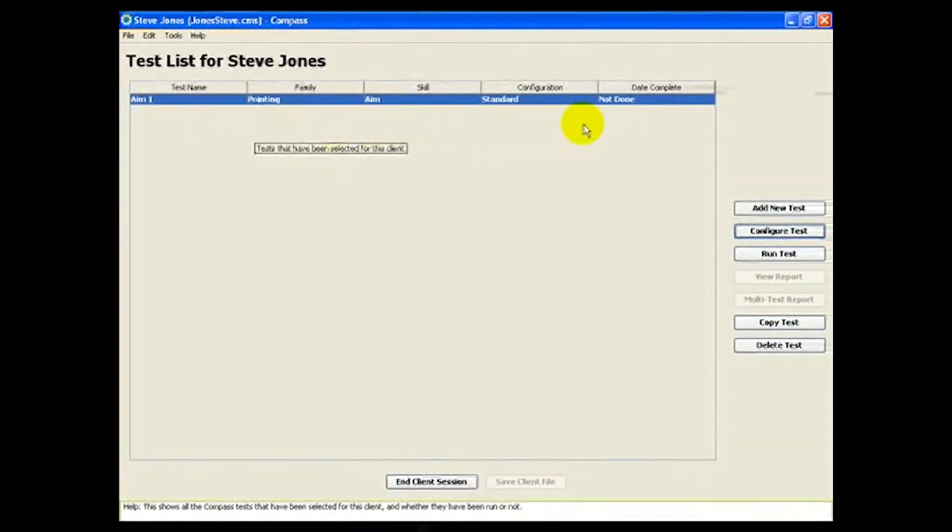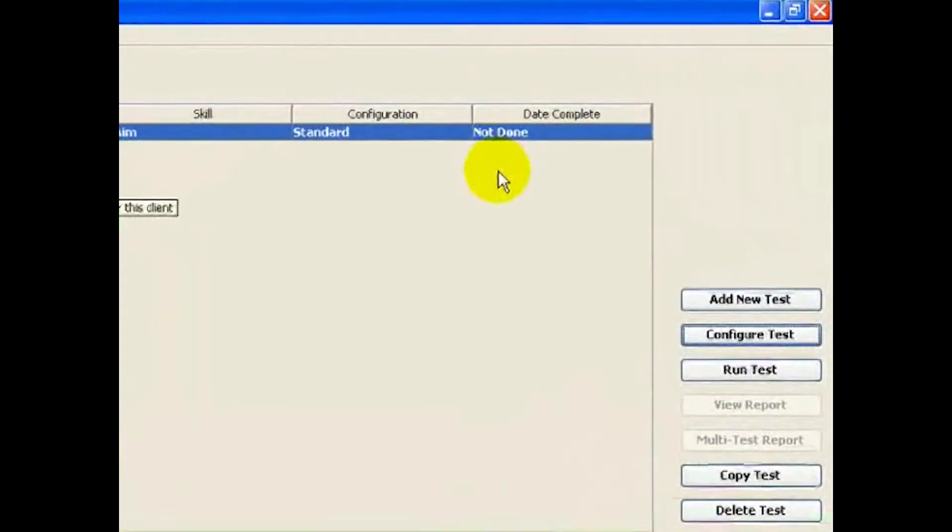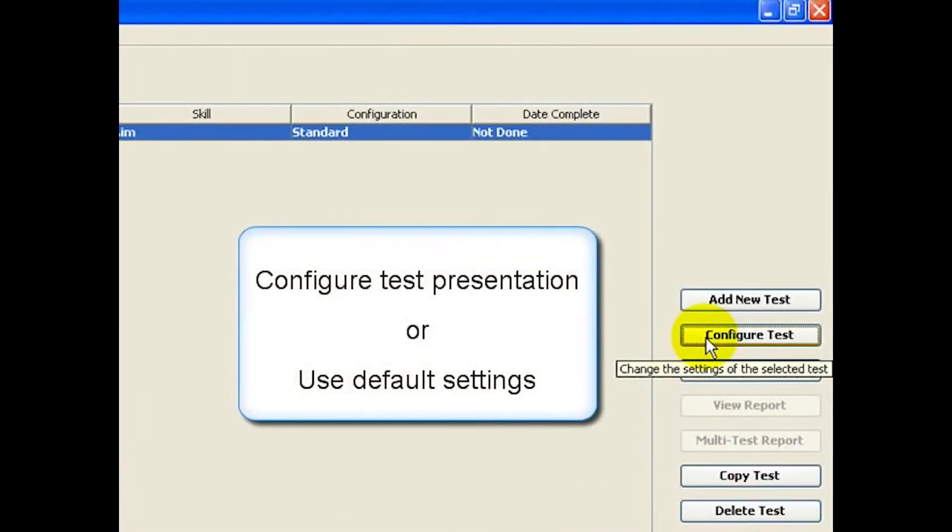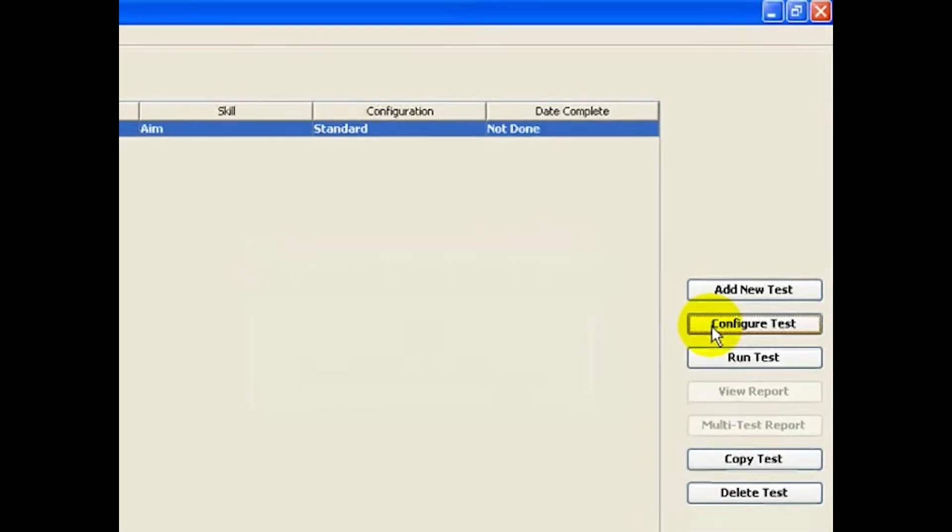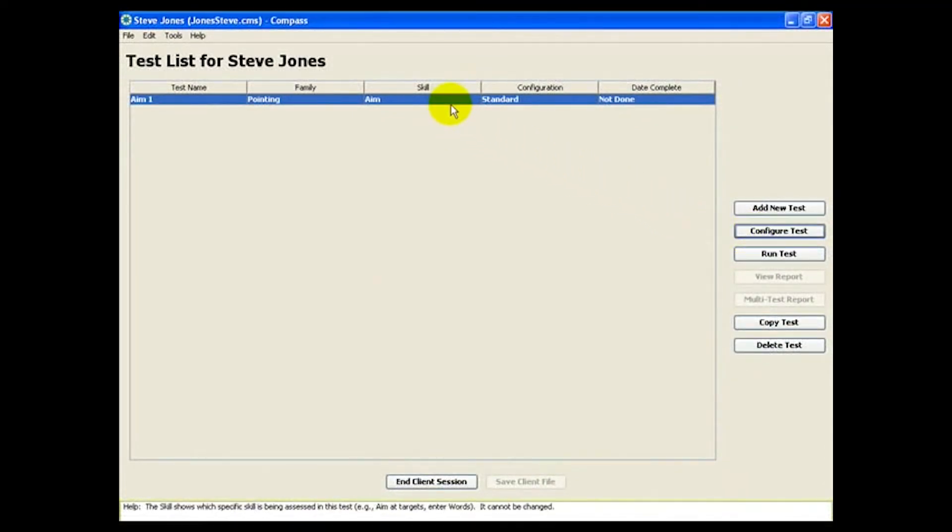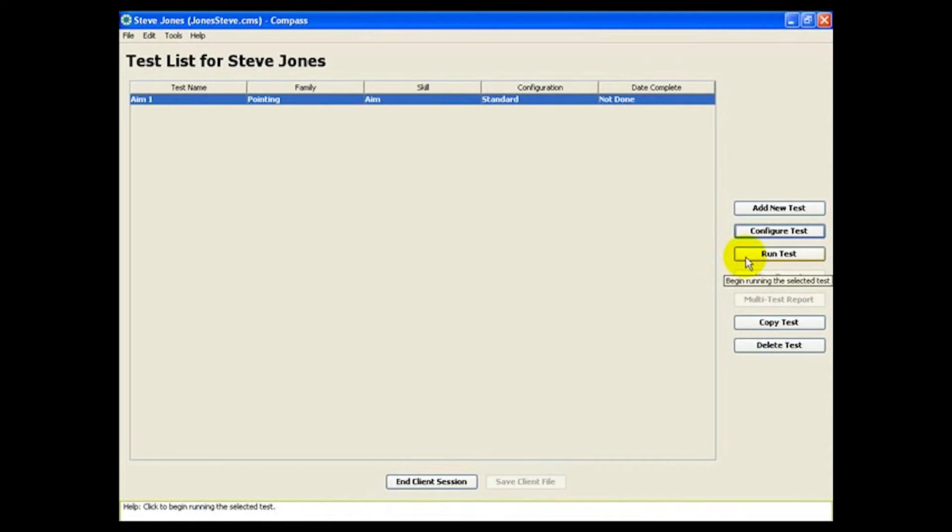If we want to, we can configure the aim test to adjust various aspects of the test presentation. But we'll just run this example with the default settings. To run the test, select it and click Run Test.